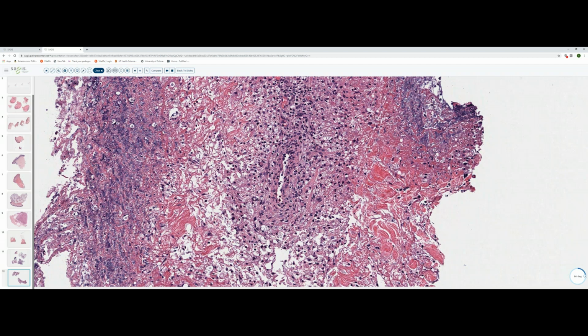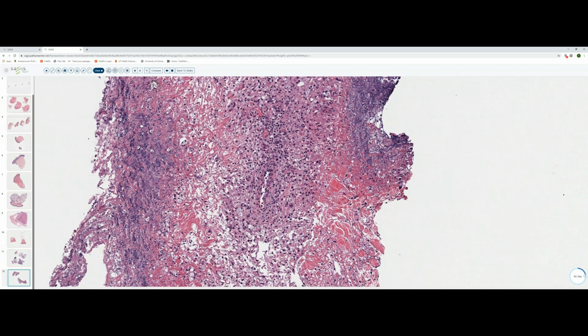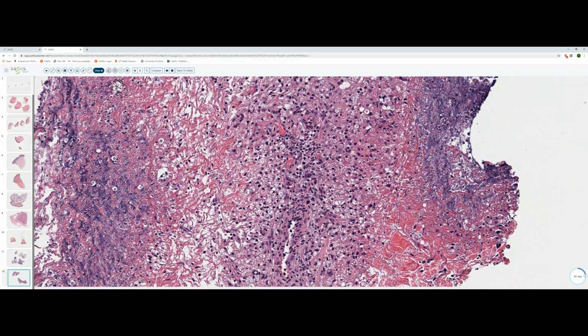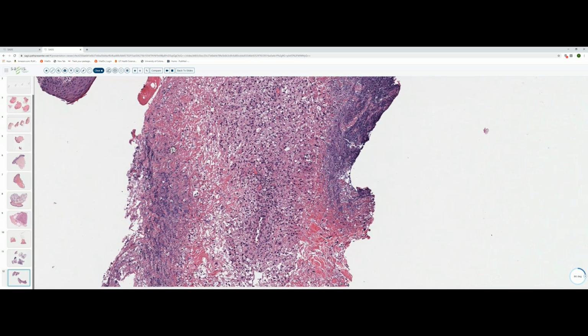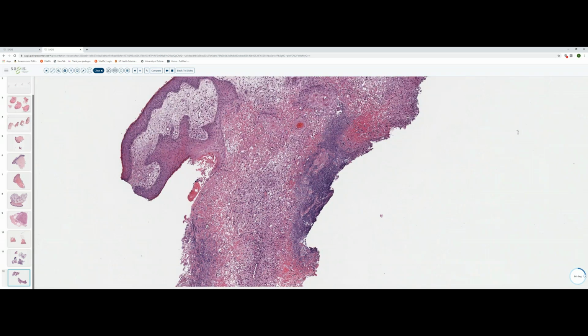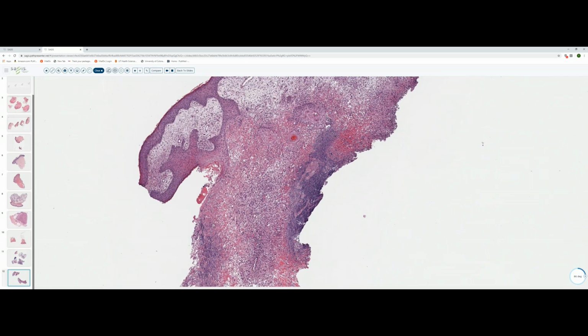Crypto also has a granulomatous form, and the granulomatous form is a little more difficult to see the organisms, and the capsules tend to be small. So I think if they were to give you one on the board, you'd probably get a gelatinous crypto, and that's the form that tends to occur in immunocompromised individuals, like those with uncontrolled HIV who develop numerous molluscum-like lesions.